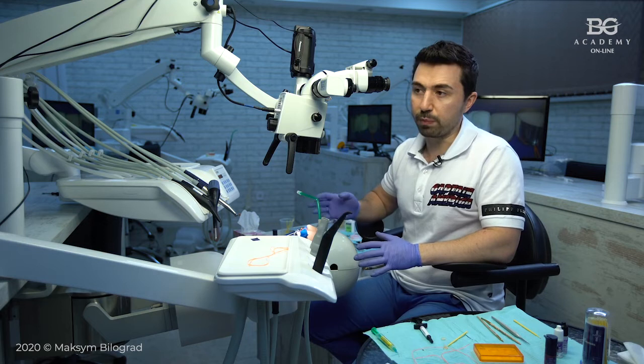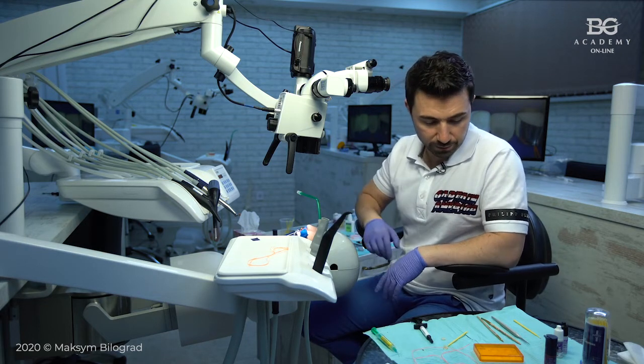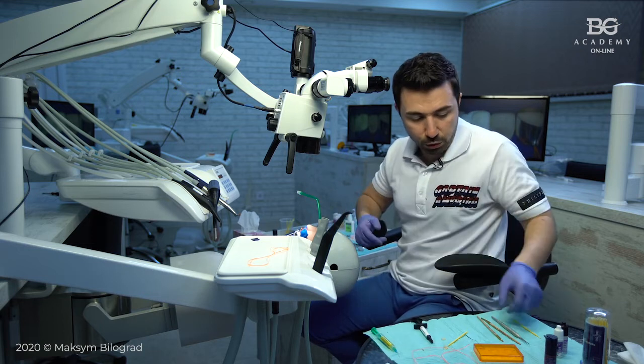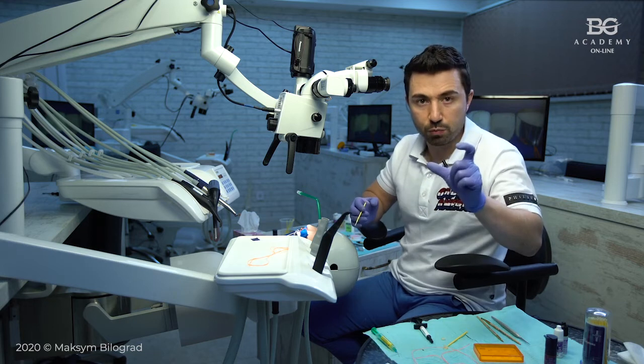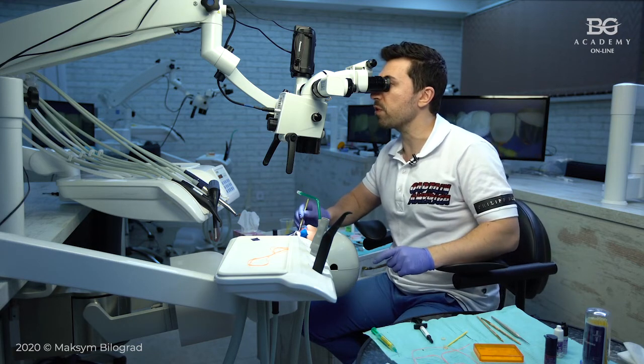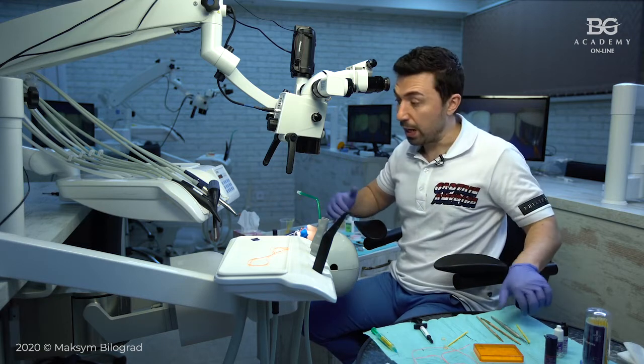In this case, we will apply adhesive to enamel or to dentin. In case you are still using, for example, a fourth generation adhesive system, which means you have a separate primer, I will put some primer here in the area, potentially around this filling, then dry, and then I will put adhesive.